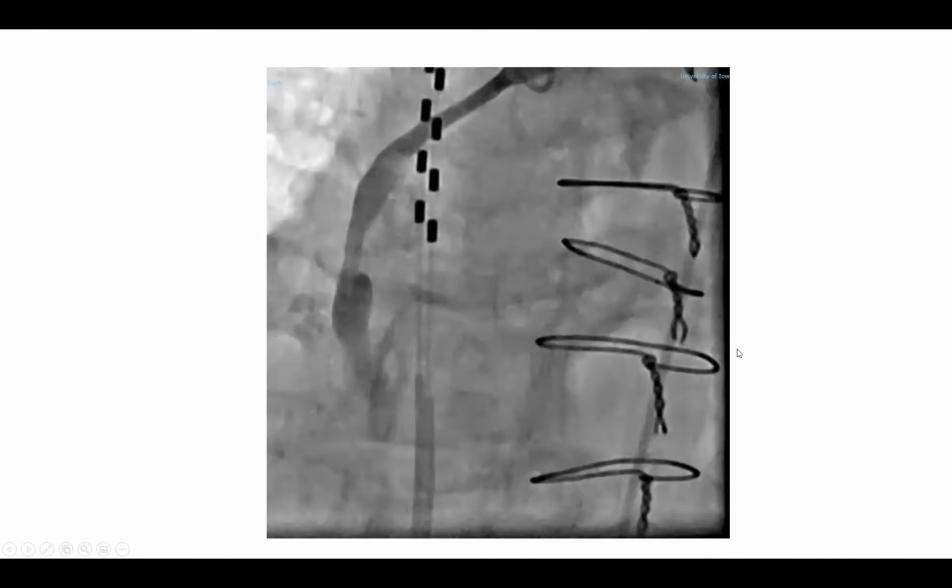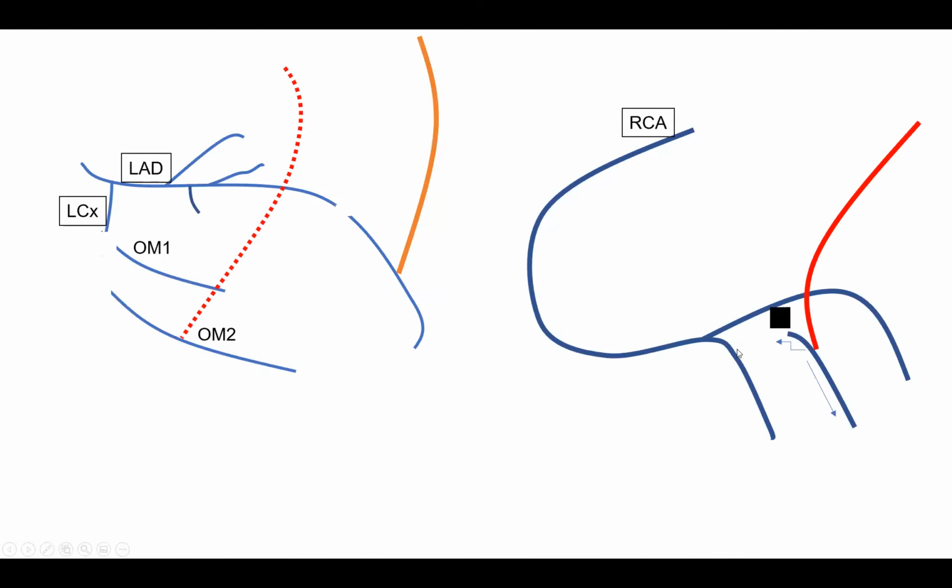So now let's map the anatomy of this patient. We did everything on him. We did all the graft. All the grafts are open, but that doesn't mean he doesn't have a problem. So he has patent LIMA to LAD that only fills the apex of the LAD. Retrogradely, there is a subtotal occlusion, and it doesn't fill the proximal diagonal. Luckily for him, those proximal diagonals have unobstructed flow through the left main prox LAD.